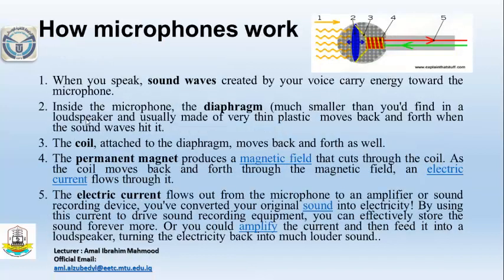Now, we will discuss how the microphone works. First step, number 1. When you speak, the sound wave, which is the mechanical wave created by your voice, carries energy toward the microphone, as shown in this figure. Inside the microphone, there is a diaphragm, much smaller than you would find in the loudspeaker and usually made of very thin plastic, that moves back and forward when the sound wave hits it.